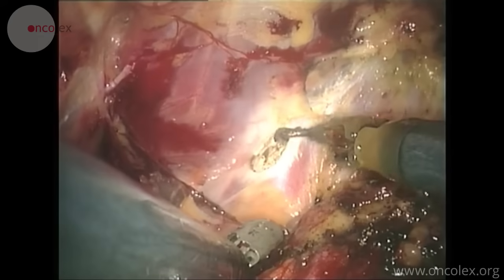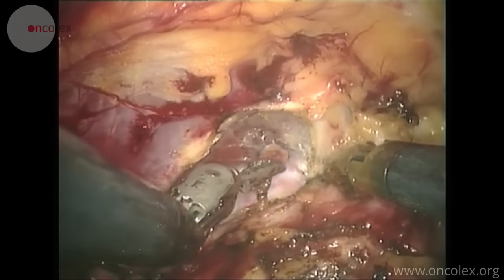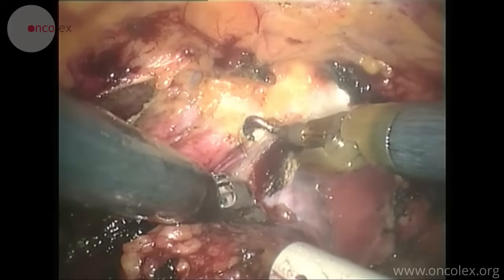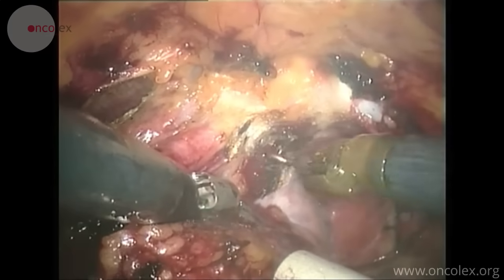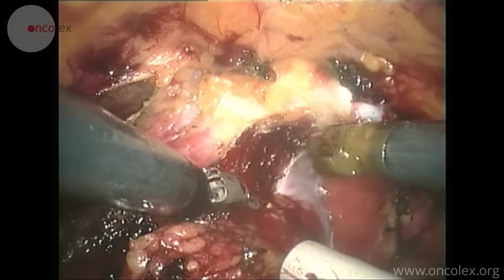The endopelvic fascia on the left side is incised. The surgeon begins cutting the puboprostatic ligaments. The venous plexus is then cut directly with diathermy.